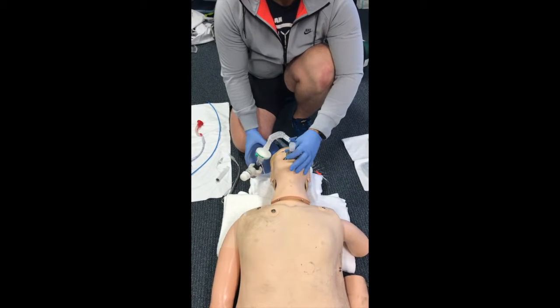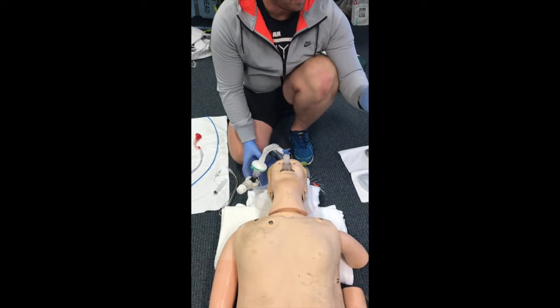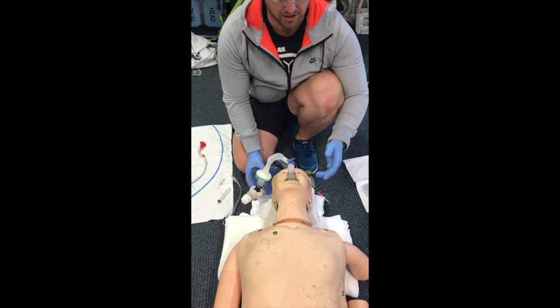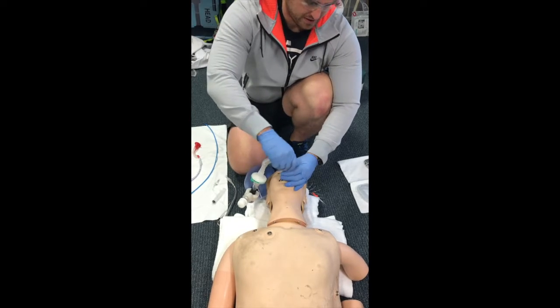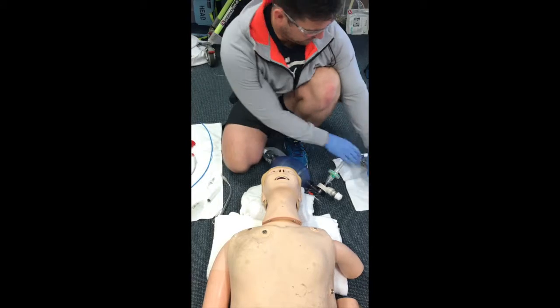After attempting to ventilate with the LMA in situ and not being able to maintain SpO2 levels of greater than 90% and not having good ventilation or oxygenation, poor chest rise and fall, I have to move on to the next step of the failed intubation drill.